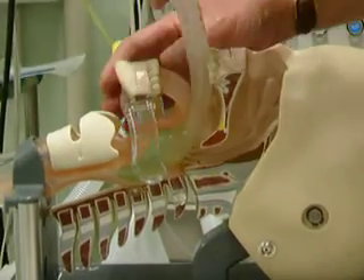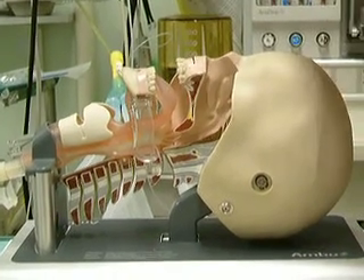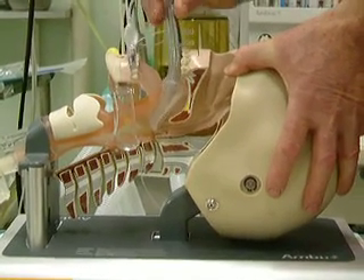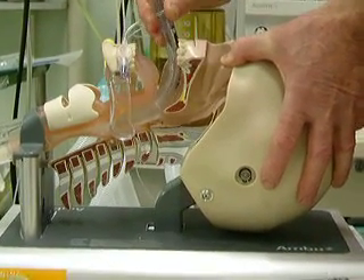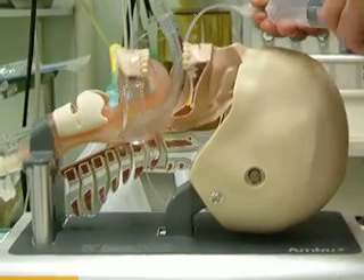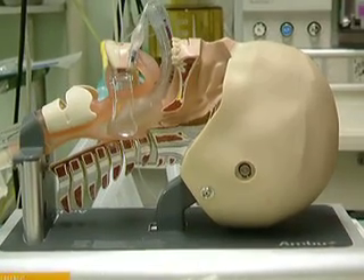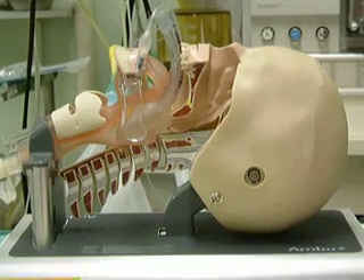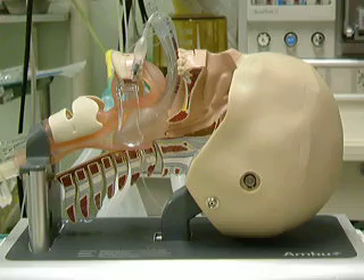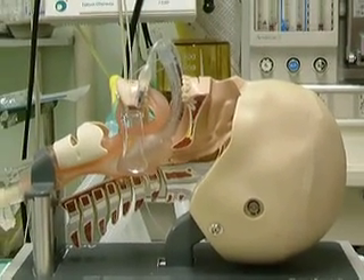If I just demonstrate with the tulip airway again — this is a deflated tulip airway. It sits just behind the tongue, inflated with 40 mils. You can see that it pulls the jaw and the tongue forward and sits over the laryngeal inlet. It gives you a demonstration there of the high volume and therefore the low pressure that it exerts.